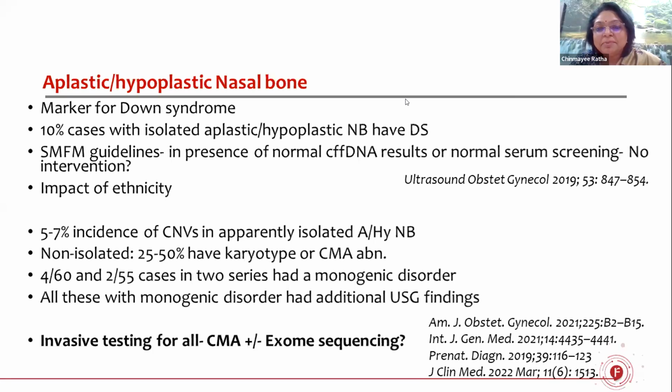So there will be many people in the audience who must be thinking that once you see an absent nasal bone, like increased NT, why not terminate the pregnancy there only? No. That is true for any finding, right? Because as we say, there's no end to investigating. And again, as you mentioned, finally you may end up with a VOUS, despite doing everything. Now, what would you tell the patient?